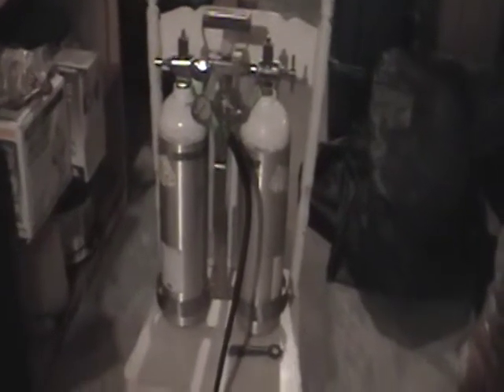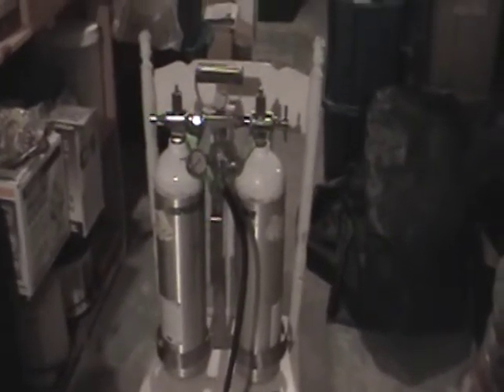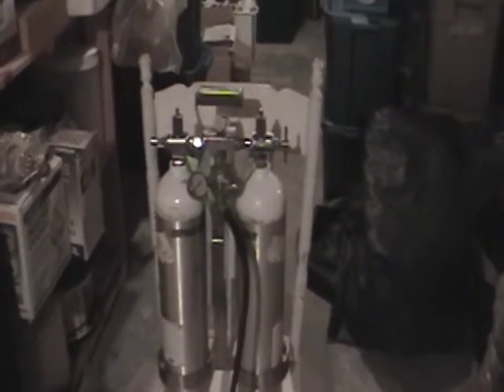So here we have two D tanks — aluminum — and it still weighs a fair amount. We can just imagine in the past when they had M cylinders that were steel, that this would have weighed a ton.